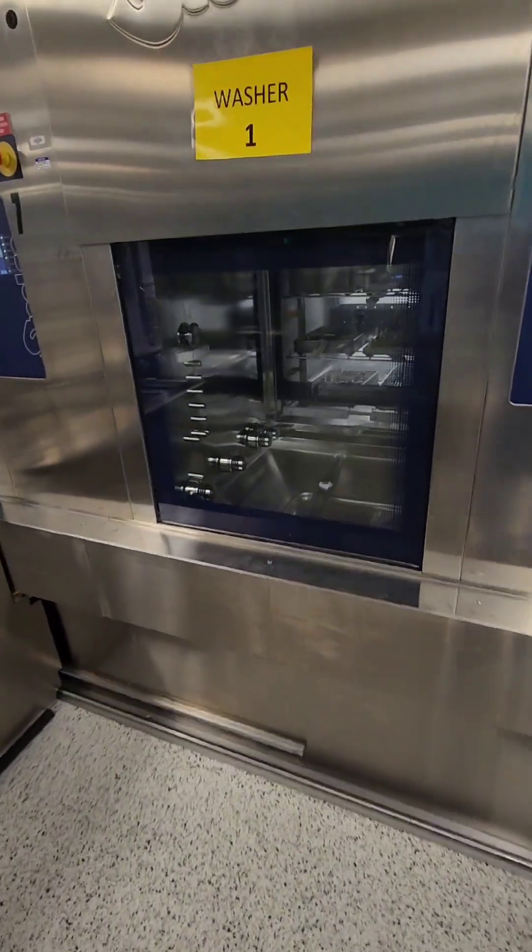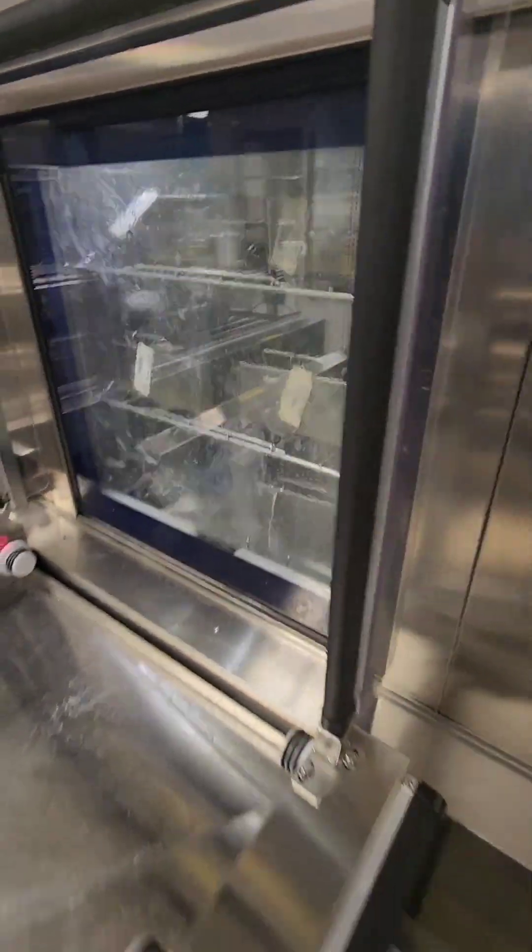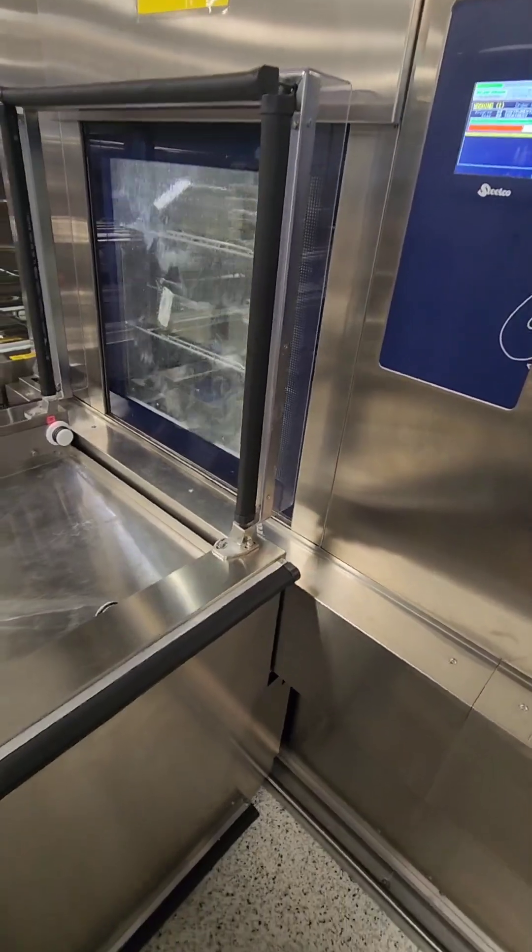So this is our automation system. Our washers are a two-in-one washer — the front chamber washes while the back chamber dries, so it's like a tunnel washer.